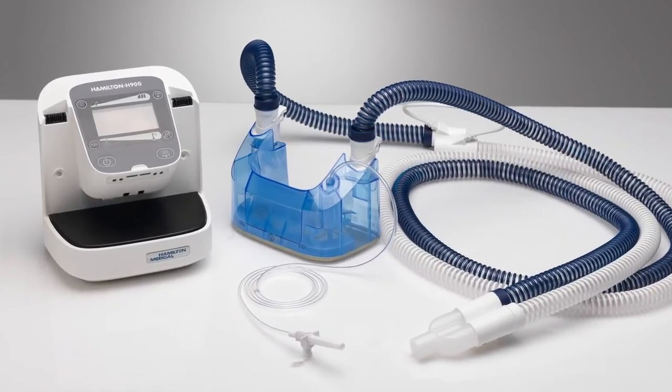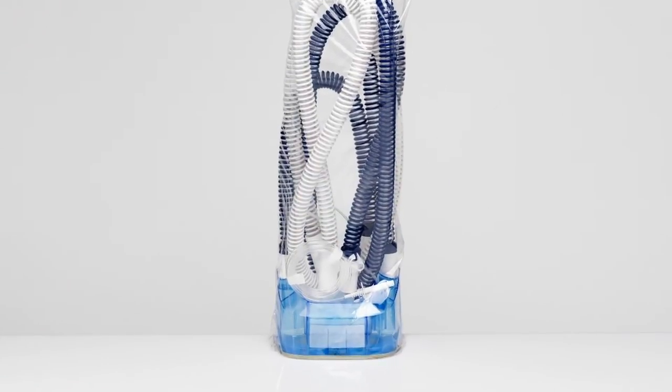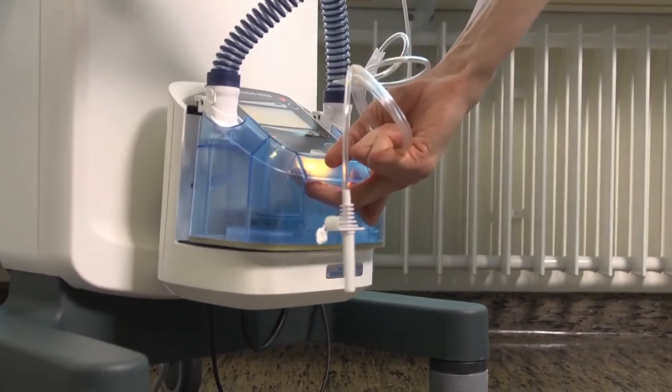The breathing set for the Hamilton H900 comes pre-assembled and packaged as one complete unit. It's very handy to get the breathing set as one — all we have to do is open the package, insert the complete set, and connect it.